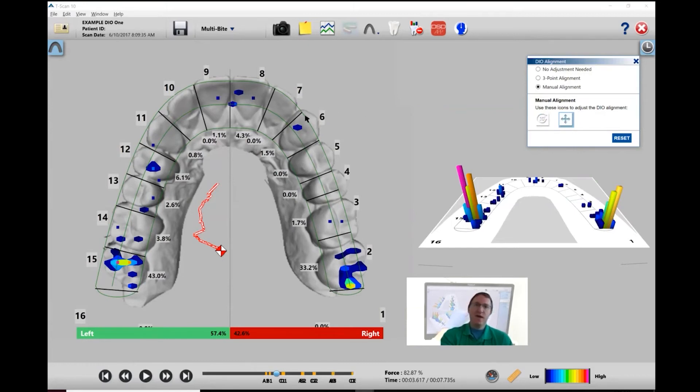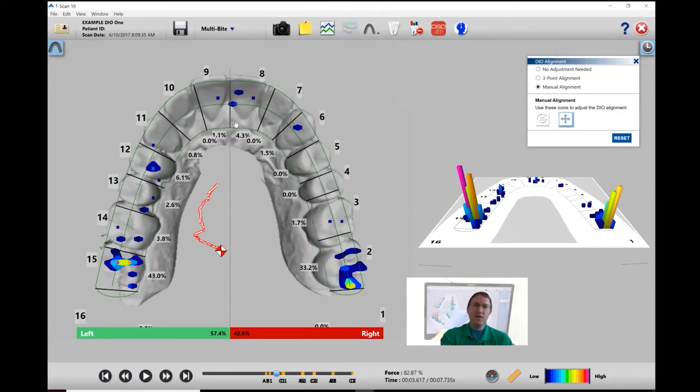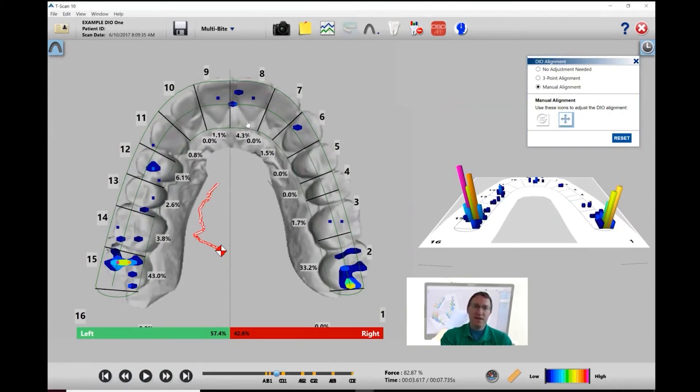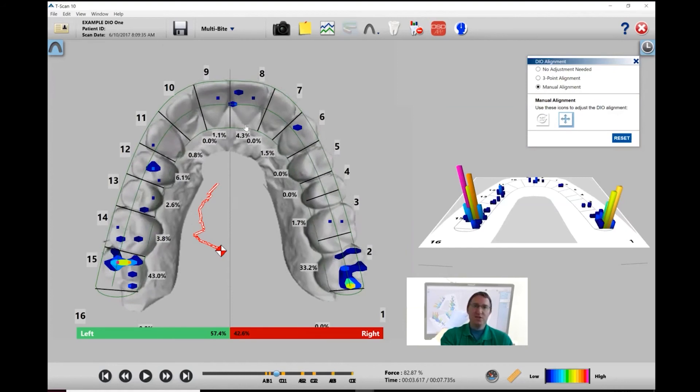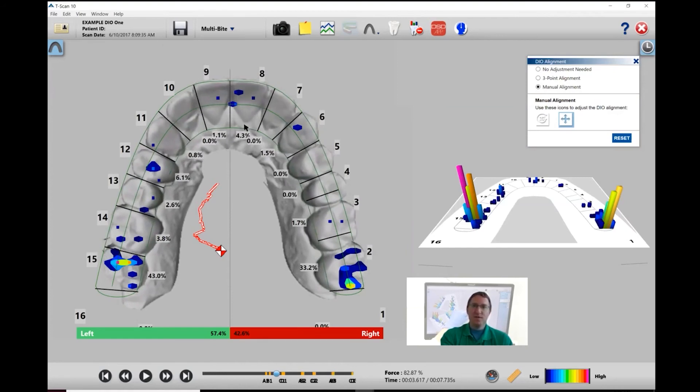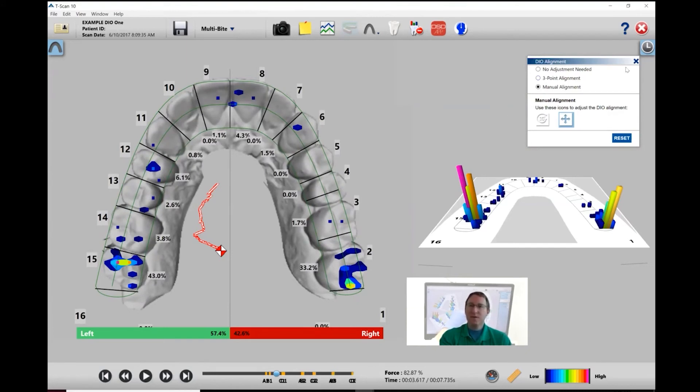To show you how to do that, you just have to left-click anywhere on the digital overlay. So left-click and hold, and you can move that digital impression anywhere you want. Once you've lined it up properly to where you want it, hit X.